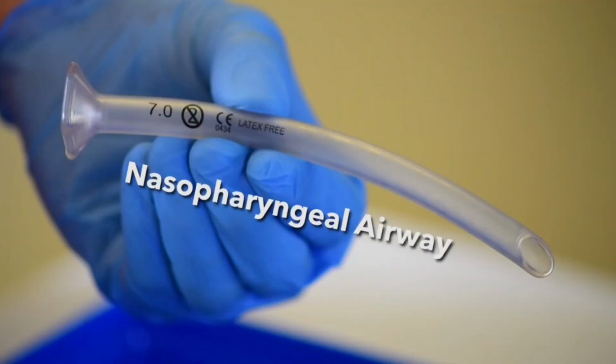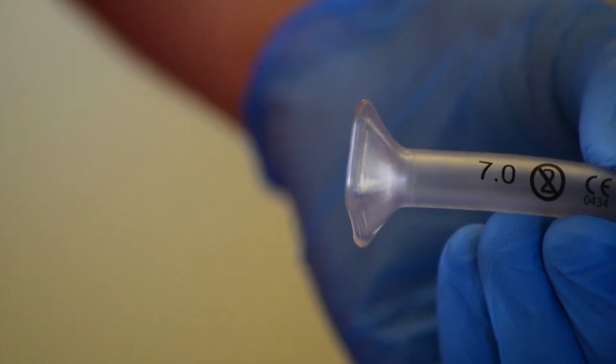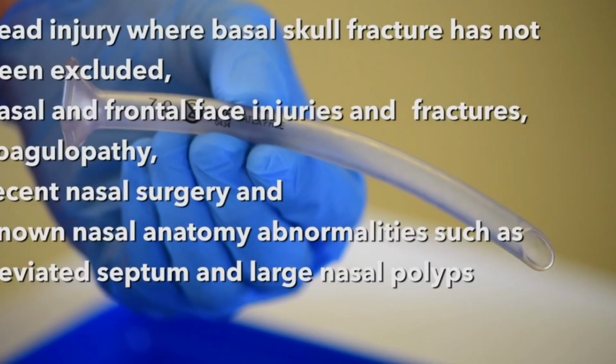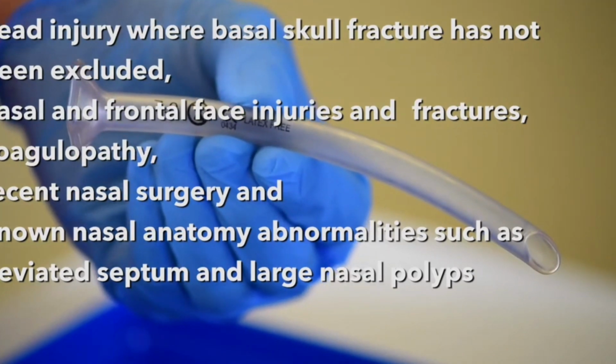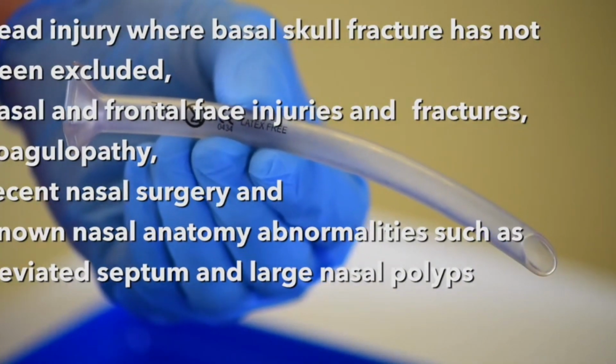The nasopharyngeal or NP airway is another adjunct that can be used to assist with basic airway management. It is a simple silicone tube with a bevel at one end and a flange at the other. It is well tolerated in semi-conscious patients. The device should be used with caution in patients with head injury where base of skull fracture has not been excluded, nasal and frontal face injuries and fractures, coagulopathy, recent nasal surgery, and known nasal abnormalities such as a deviated septum and large nasal polyps.